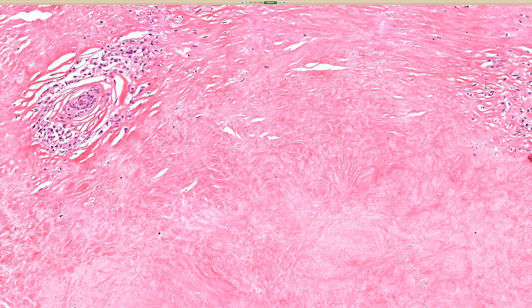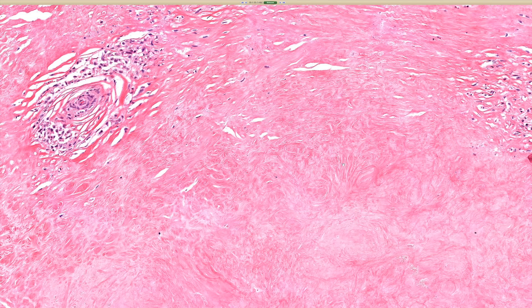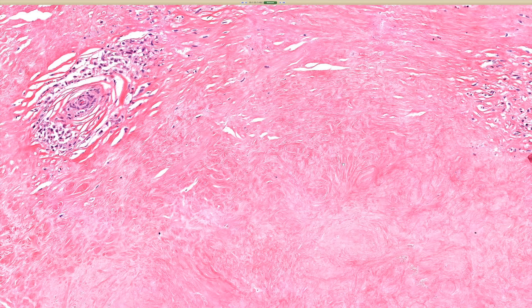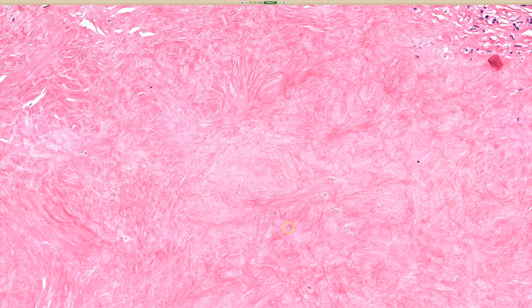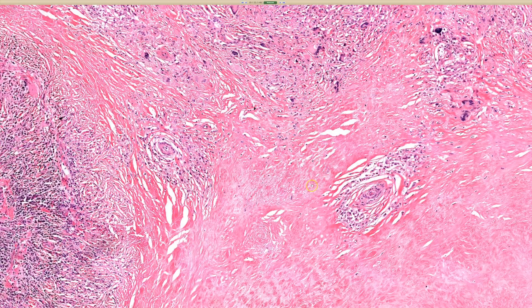Necrobiosis is a fancy way of saying collagen that's devitalized. Collagen is already extracellular — it's not even alive, right? It's an extracellular protein made by fibroblasts. The way I think of it is that usually collagen has fibroblasts with it. The dermis normally has a normal population of fibroblasts, but here we've got a bunch of collagen with basically no fibroblast nuclei. That's when I start thinking that's necrobiosis of the collagen. People have pointed out that word is kind of a misnomer, and I agree, but it's a word we've been using for a long time.